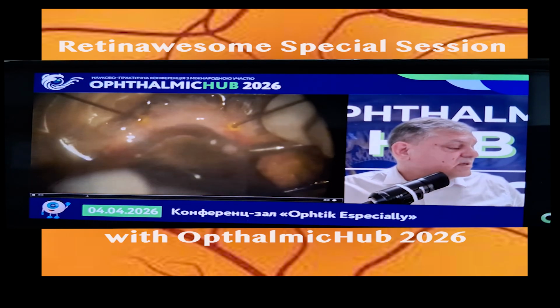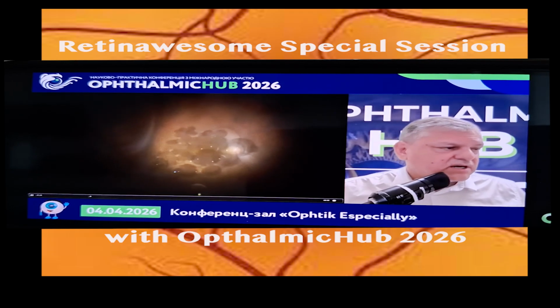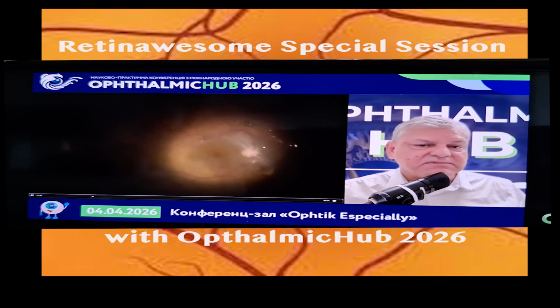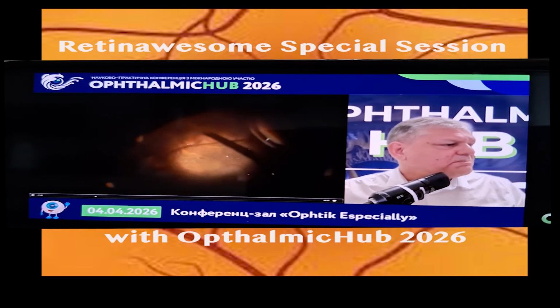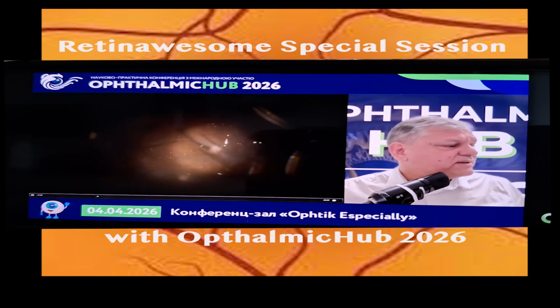You see the macula looks much better now, without threatening the central area so as not to detach it. And using the perfluorocarbon liquid now, I attach it even more and protect the retina.